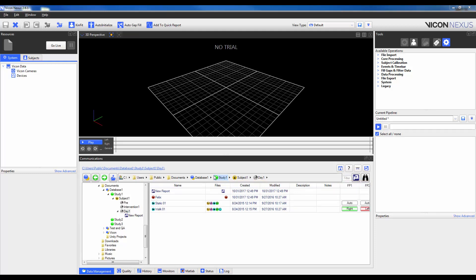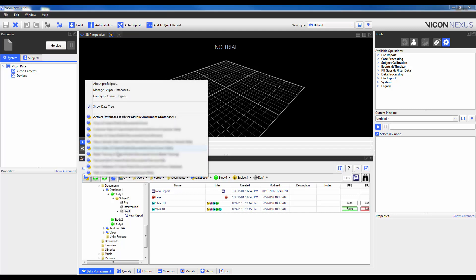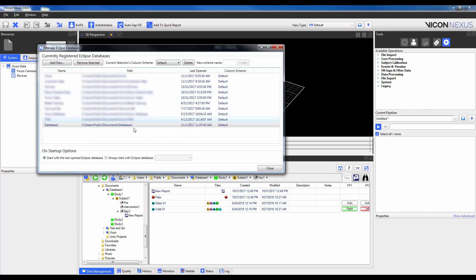The exact display of columns is saved to a configuration called a Column Scheme, which is found within the Manage Eclipse Databases option through the ProEclipse menu. Each database will have a Column Scheme specified, and all subsequent sessions within that database will have the same Column Layout. We can see here that all databases are currently using the default Column Scheme.